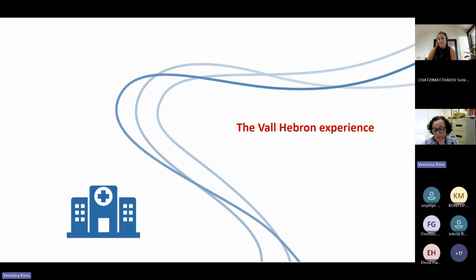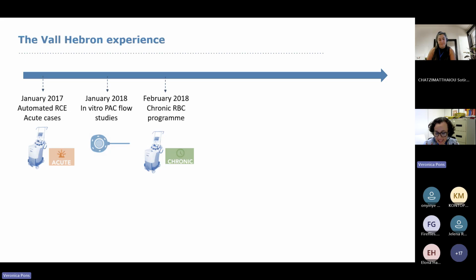And what has been our experience in our hospital? So I'm going to explain our experience. The first cases of red cell exchange and acute complications were in January 2017. After a year, we conducted the first in vitro studies with different ports to select the most suitable one. And the chronic program began in February 2018.